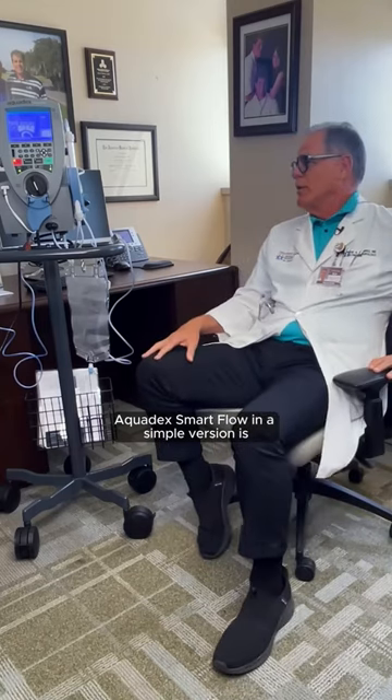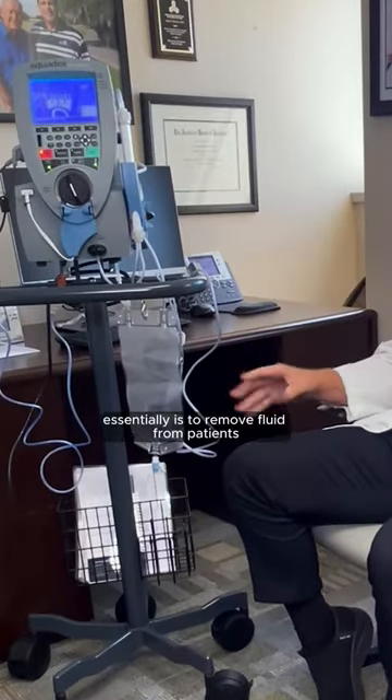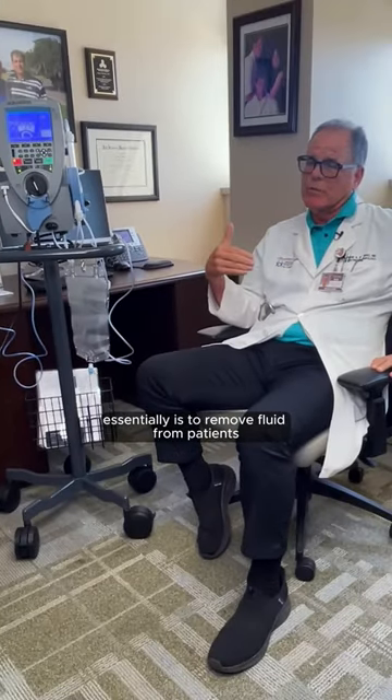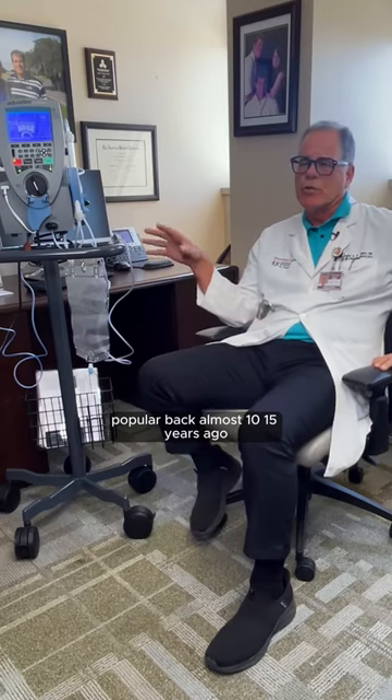Aquadex SmartFlow in a simple version is a console with a tubing system, and the aim of this machine essentially is to remove fluid from patients. This first became popular back almost 10 to 15 years ago.